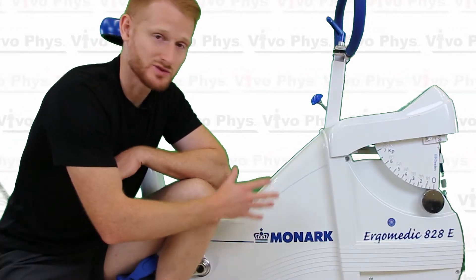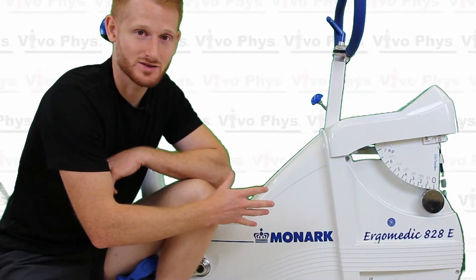Hi, I'm Dr. Edward Matthews. I'm here at Montclair State University in the Exercise Science Lab to show you how to use a Monark Ergomedic 828E exercise bike.